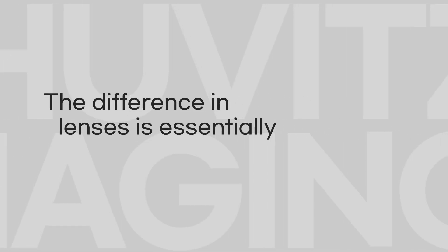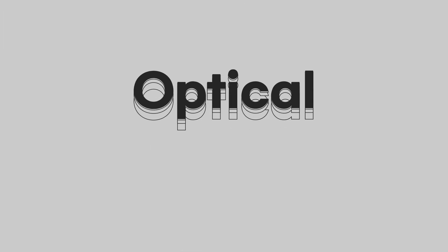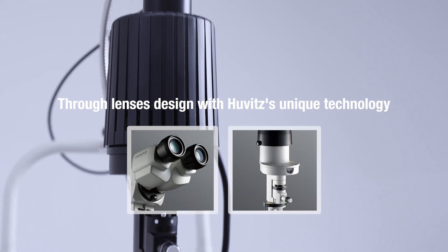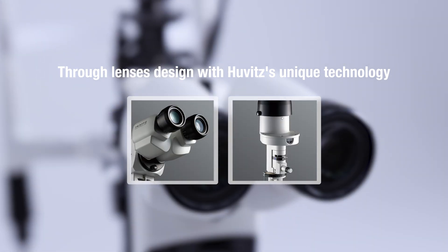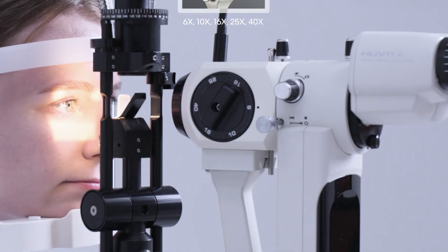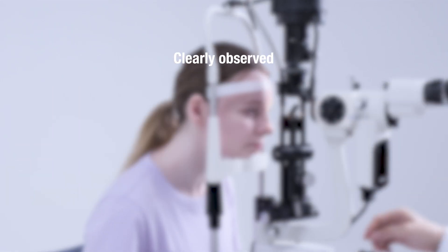The difference in lenses is essentially the difference in quality. Huvitz slit lamp, through lenses designed with Huvitz's unique technology, even with quick magnification changes, clear observation is possible without loss of image quality.